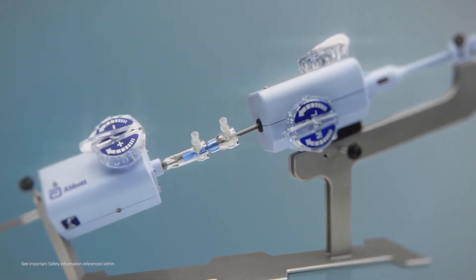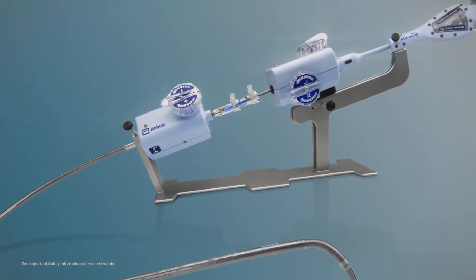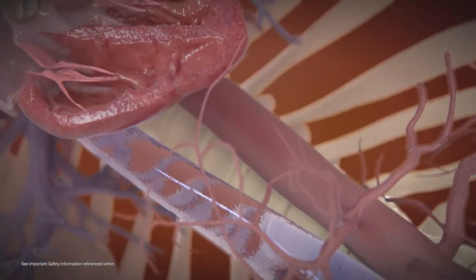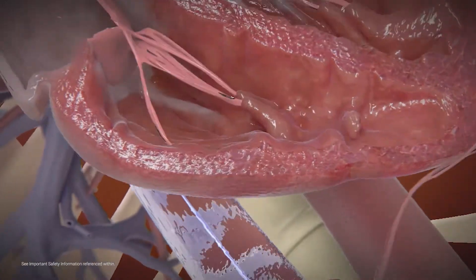MitraClip is a unique, highly manoeuvrable trans-catheter system for mitral valve repair. This procedure avoids cardiopulmonary bypass using a minimally invasive venous approach and trans-septal puncture to gain access to the left atrium.